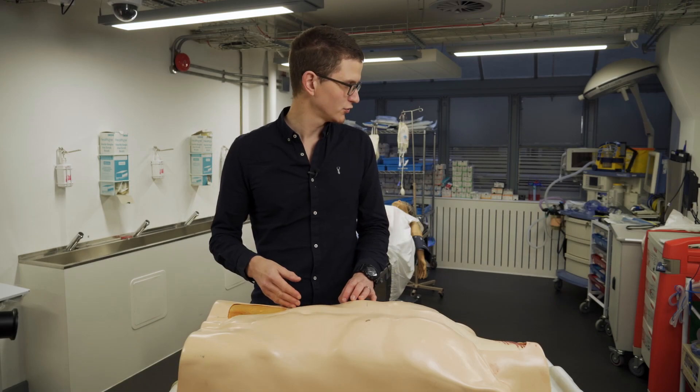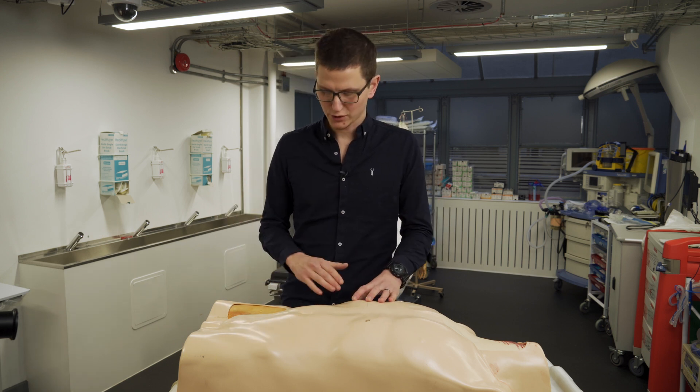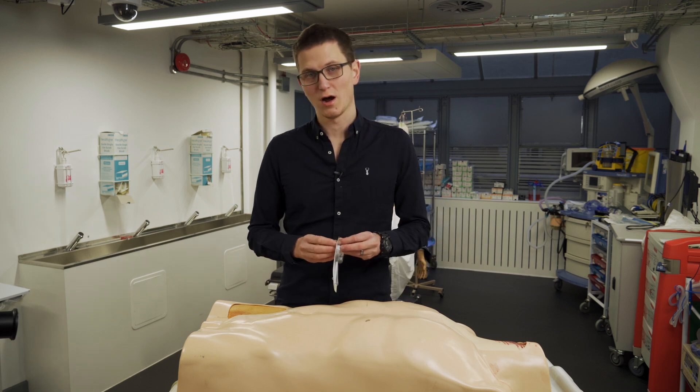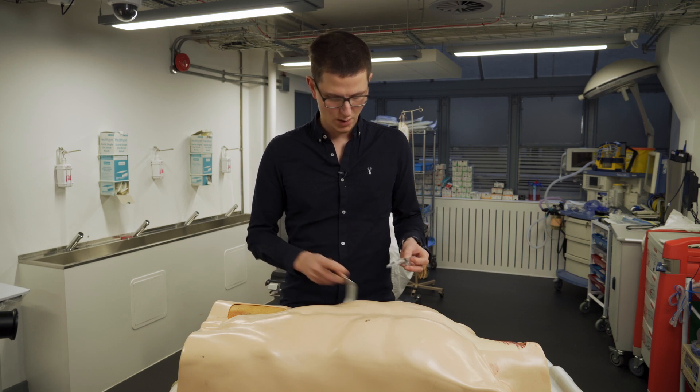We are looking at how to cannulate the femoral vein. How do we do this? What are we trying to do? We're trying to get the cannula into the femoral vein, but it's quite deep and can be quite hard to find. So let's quickly work out how we actually find this.